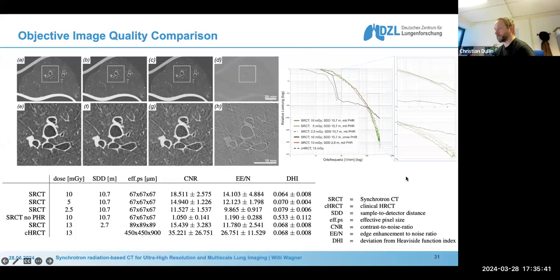But this is something we cannot test here in Italy. That's the problem. So Juliana is very much interested in also doing scans at, let's say, 120, just to see what we can get from the phase contrast and in relation to the dose. So I'm sorry, I don't have a real answer yet. I can only tell you 60 was the plan, but maybe we will go higher.